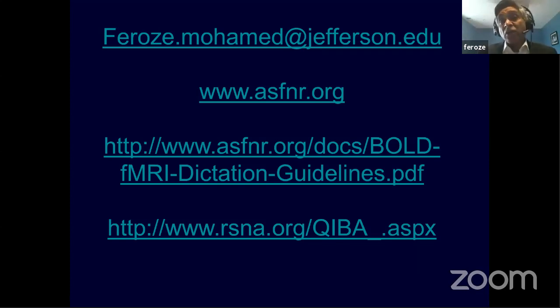ASFNR also came up with a white paper on the best language mapping paradigm to use, and sentence completion was on the top of the list. There are also dictation guidelines for both BOLD as well as DTI, on how to dictate from a radiologist perspective.